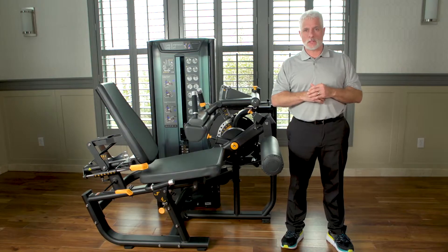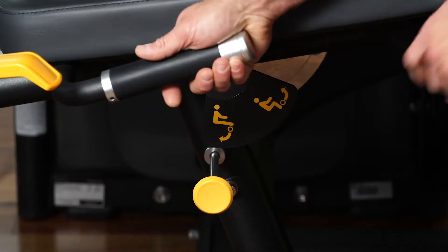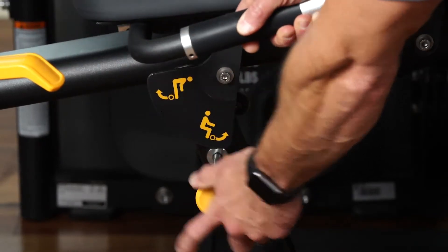One of the biggest keys on a leg extension or leg curl is the joint angle and the joint axis. This machine provides you with the ability to line that up whether you're doing a leg extension or leg curl.